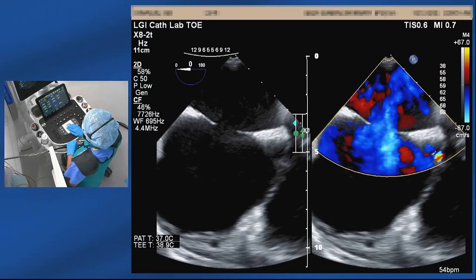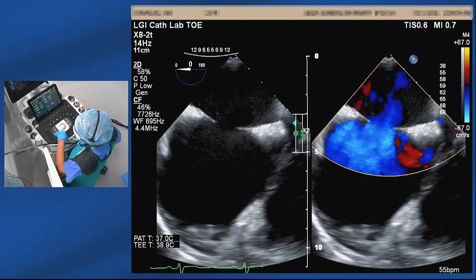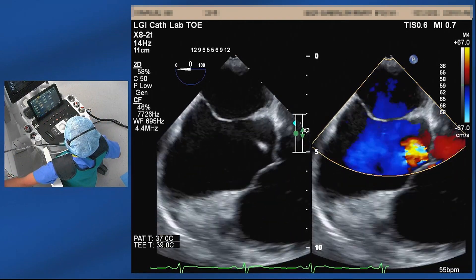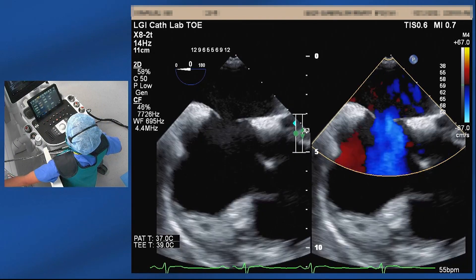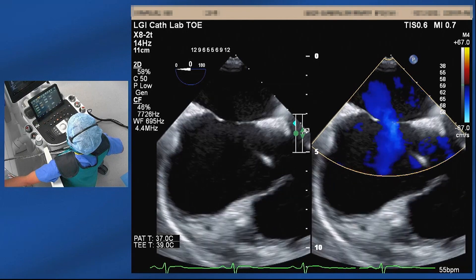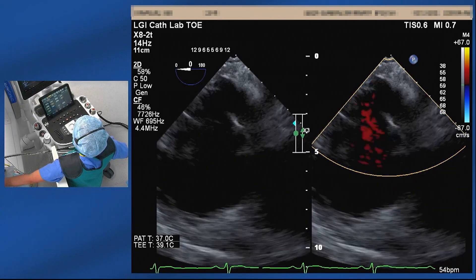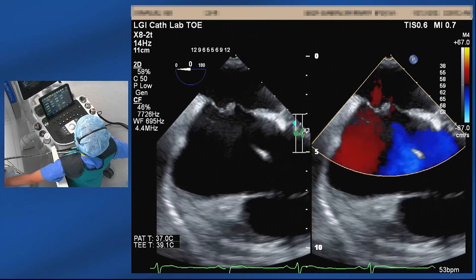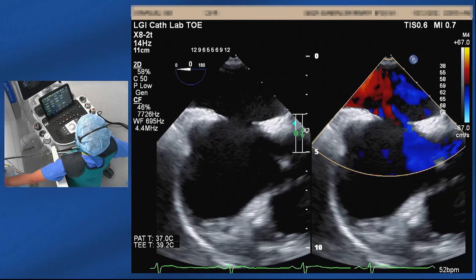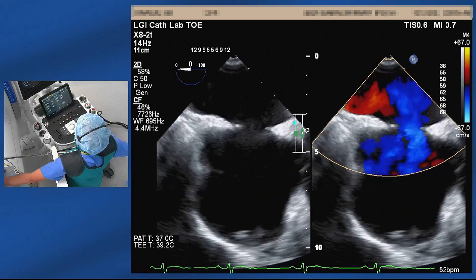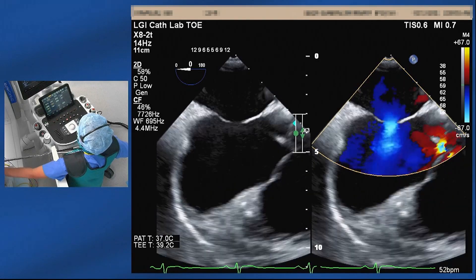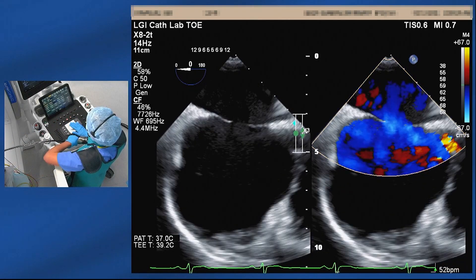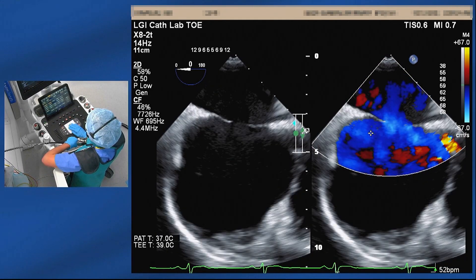We start from zero degrees, always going systematically with color, looking at the shunt across the defect, and then sweeping from posterior to the anterior part to make sure that we're not missing any additional defects, all the way up to the pulmonary veins. We've done measurements already, but it's important that we make measurements every single step, always with the color on.